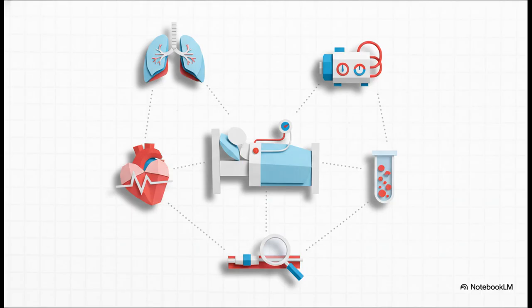It involves constant, comprehensive monitoring across multiple interacting domains. We are, of course, watching the patient's hemodynamics and their native lung function like a hawk, but we are just as responsible for the circuit itself, monitoring flows, pressures, gases, looking for any sign of malfunction. And critically, especially in an awake, moving patient, we are absolutely vigilant about cannula position and security, because a dislodged cannula is nothing short of a catastrophic code-level event.